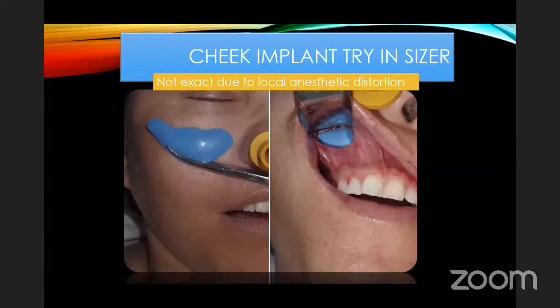At this point, I'll irrigate the pocket with antibiotic solution and use a tonsil clamp to place the implant. These implants are anatomic. In other words, they are fabricated on human skeletal analogs, so they almost automatically sit where they want to live. They are concave on the bottom, so they will fit on the bone.